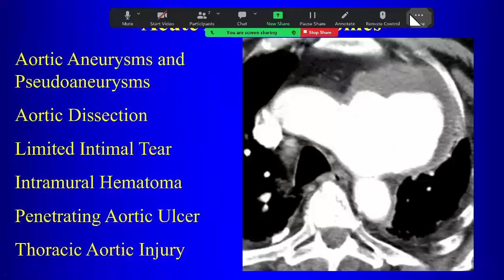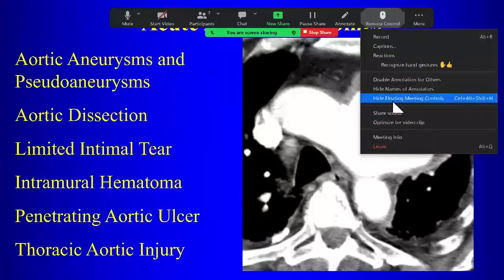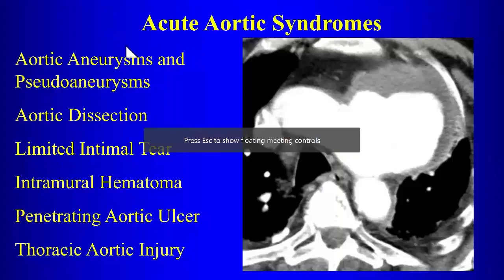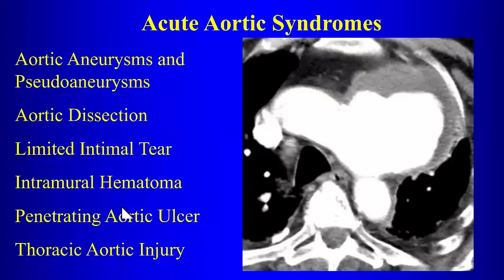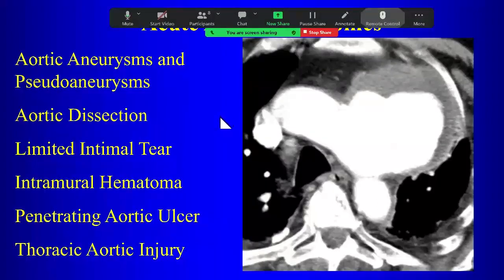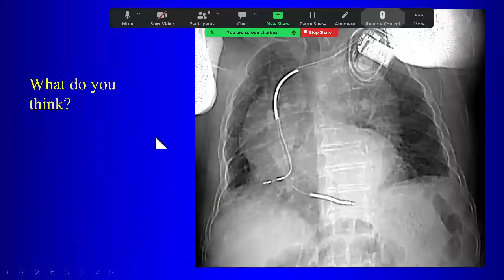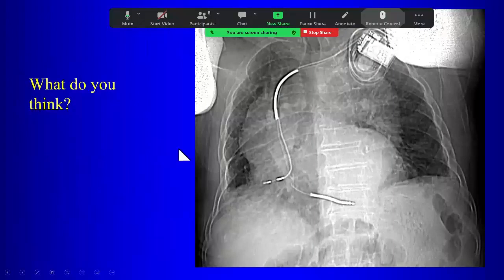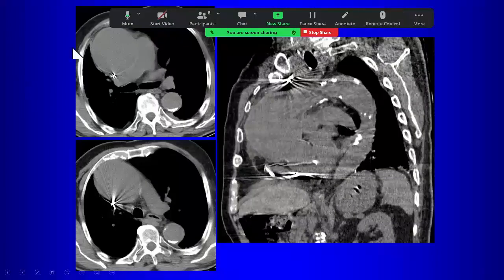Now let's talk about acute aortic syndrome. These patients usually present clinically the same way — with chest pain radiating to the back — and the ER often wants to rule out aortic dissection. We start with a chest radiograph, and when we can see the thoracic aorta is markedly enlarged, we suspect an aortic aneurysm, as demonstrated in this case with a large aortic aneurysm.